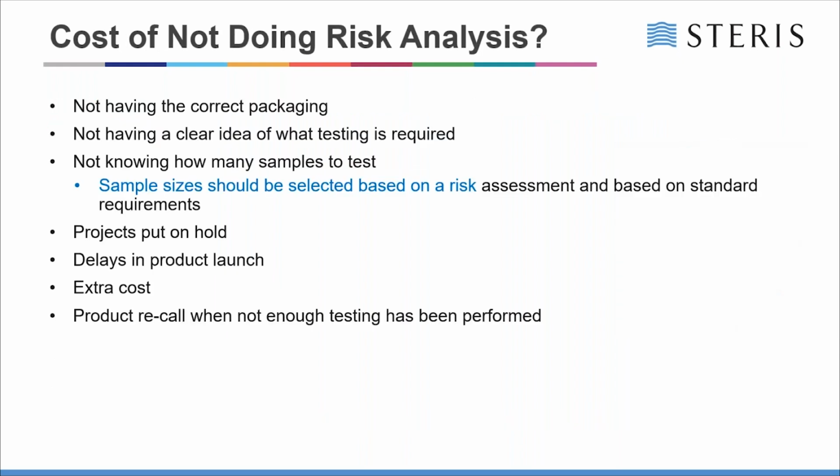In relation to doing that or not doing that risk assessment, what are the issues there? You're not going to have the correct packaging, basically, not having a clear idea on what testing is required, not knowing how many samples to use. That is actually one of the most often asked questions that we get. How many samples, and why do we have to use that amount of samples? Again, that goes back to your risk assessment and the confidence and reliability of the actual packaged product that you want to achieve.